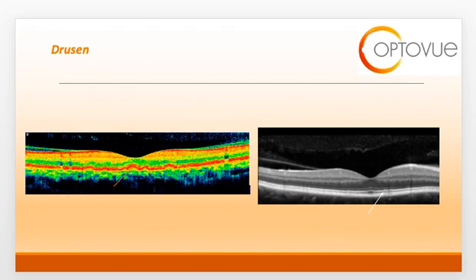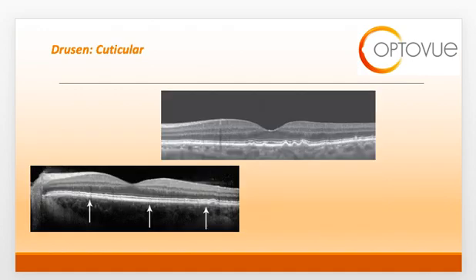On the left-hand side, you can see what soft drusen look like on an OCT. Soft drusen are larger, dome-like elevations that are irregular in shape with indistinct margins.